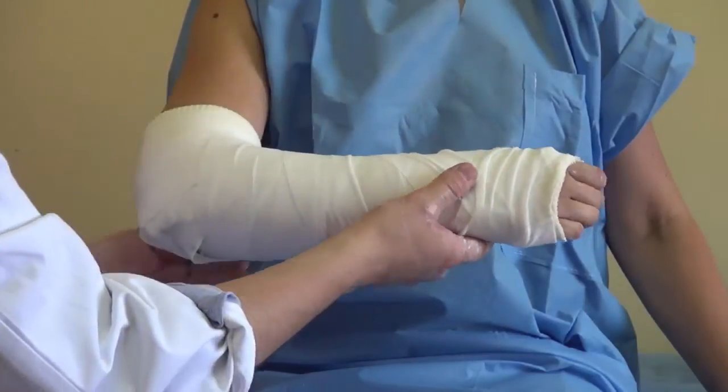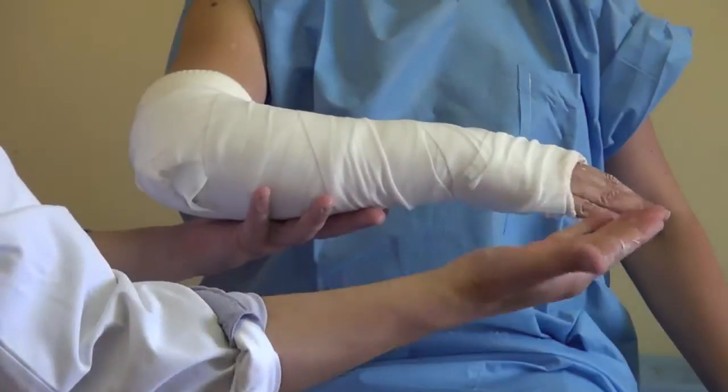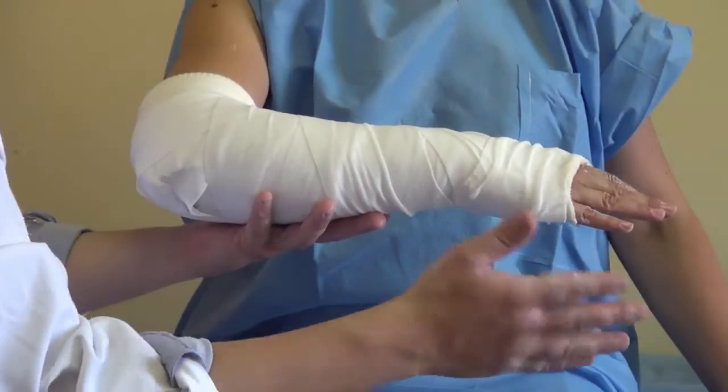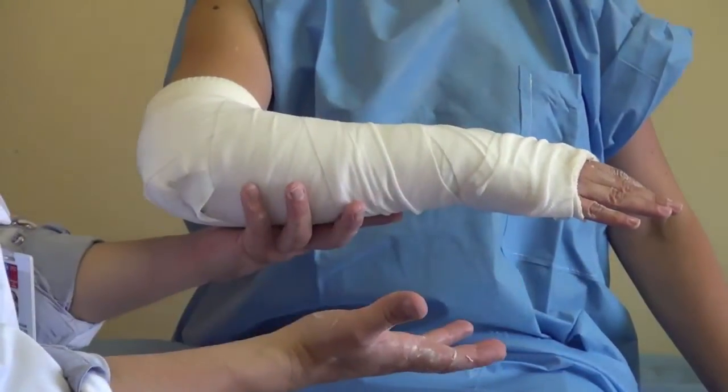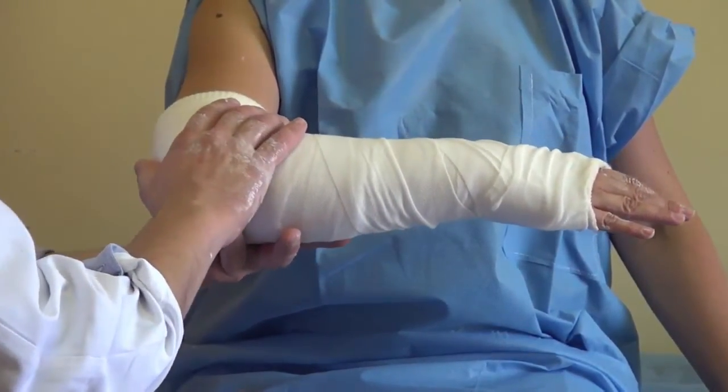This type of cast helps prevent wrist flexion and extension and also avoids pronation-supination. It's a very easy-to-use cast that keeps problems away, and it is very well tolerated by the child.